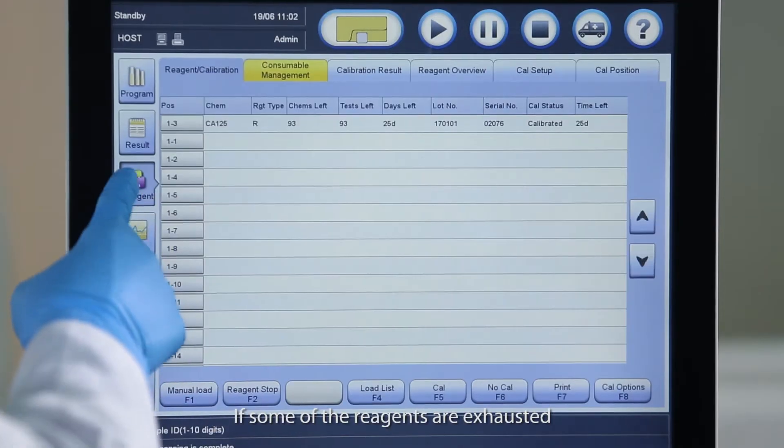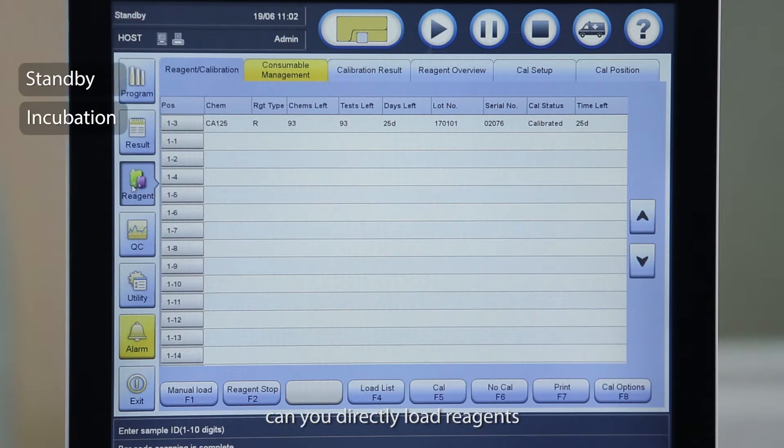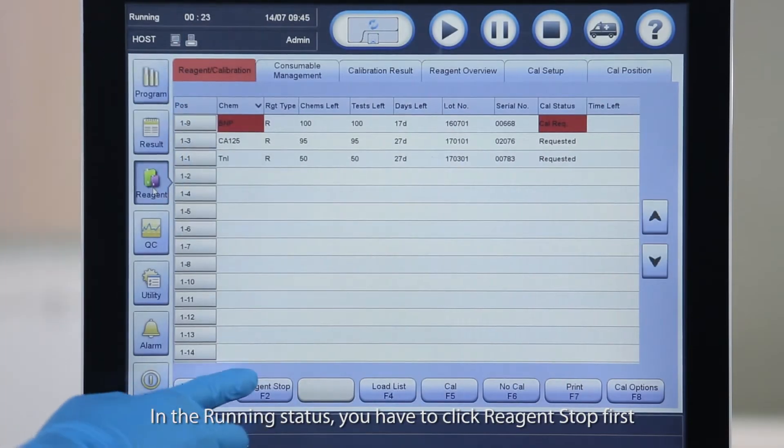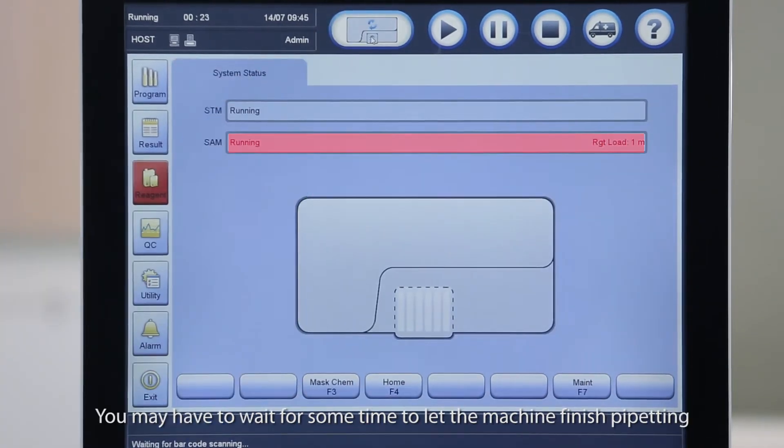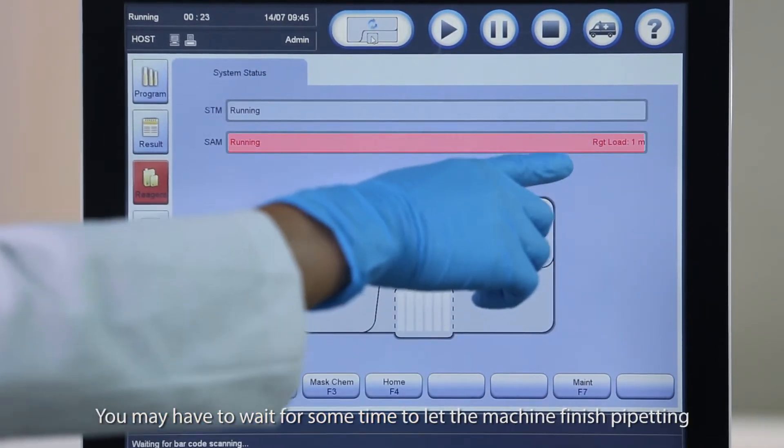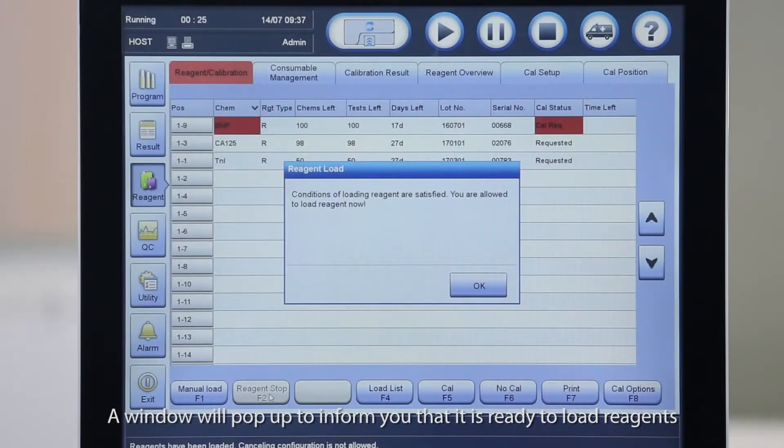If some of the reagents are exhausted or you need to add more reagents, please first check the status of the system. Only when it is on standby or incubation can you directly load reagents. In the running status, you have to click reagent stop first. You may have to wait some time to let the machine finish pipetting. A window will pop up to inform you that it is ready to load reagents.